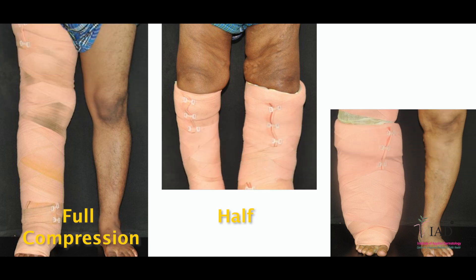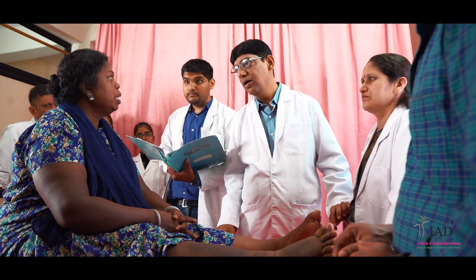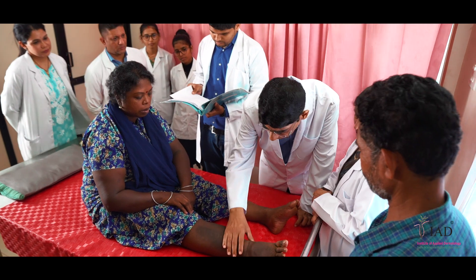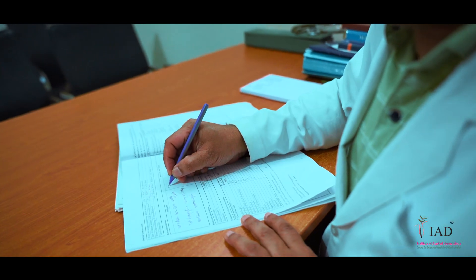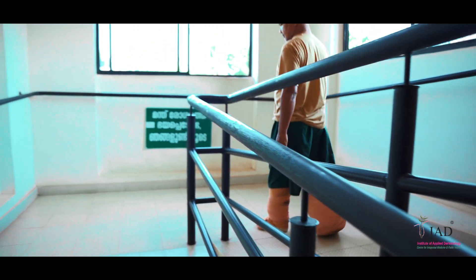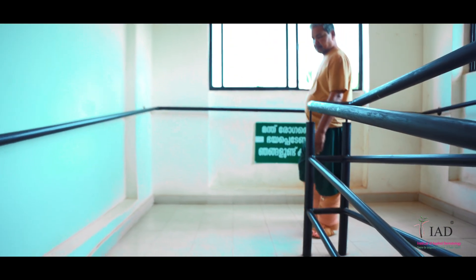Compression may be given as full compression, half compression, or half and half compression as per the doctor's advice. Compression protocol will vary and will be decided by the treatment team for each patient. Therefore, it is important to understand the bandage tying method used by the compression therapist or nurse when it is done at the IAD centre.